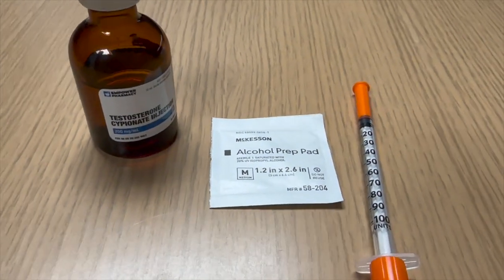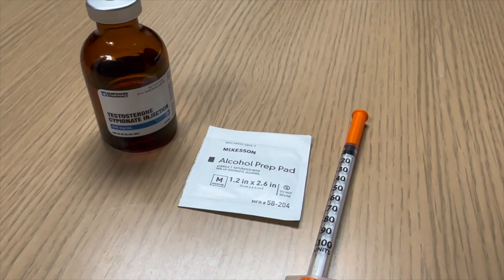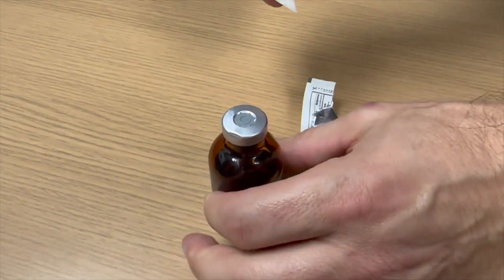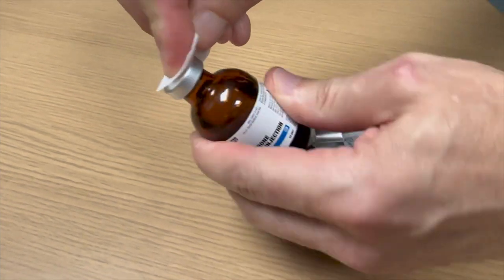First you'll need a vial of testosterone, your alcohol cleaning swabs, and your syringe. Begin by wiping the top of the vial with a clean swab and allowing it to air dry.